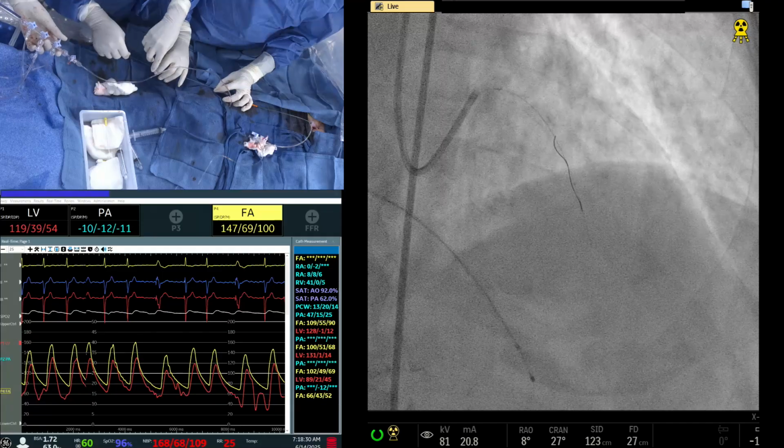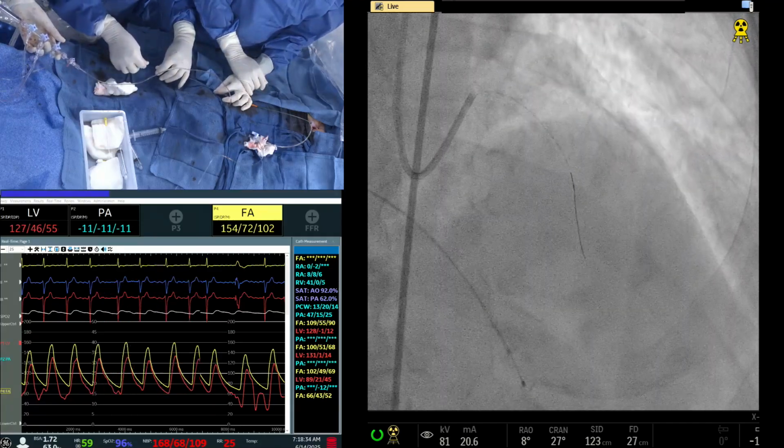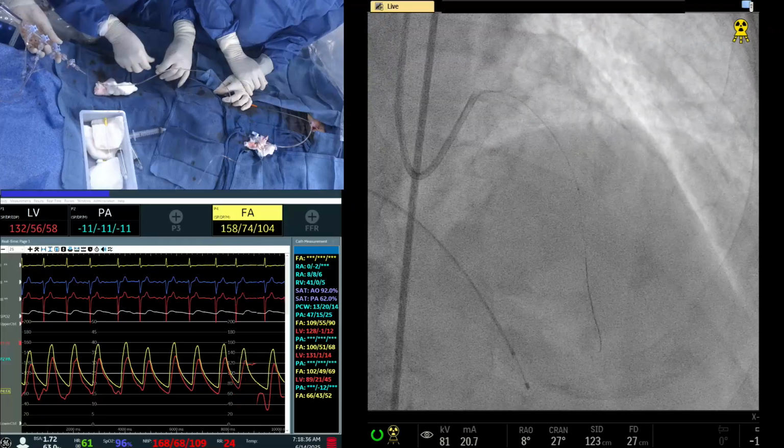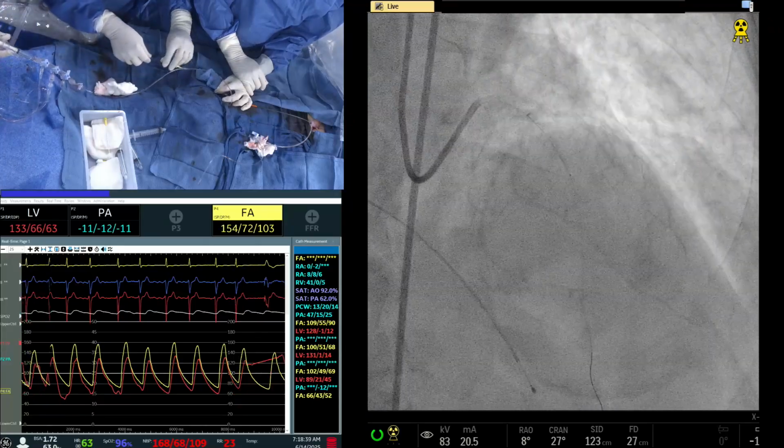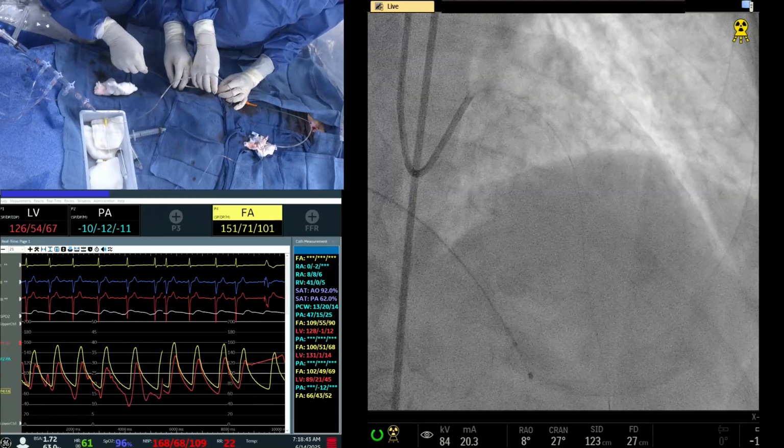Go. Okay. Fine Cross. 1 second. Yeah. It's a Fine Cross. So we thought that this case is not a rota case directly. Good. Advance. Advance. Good. With rota.